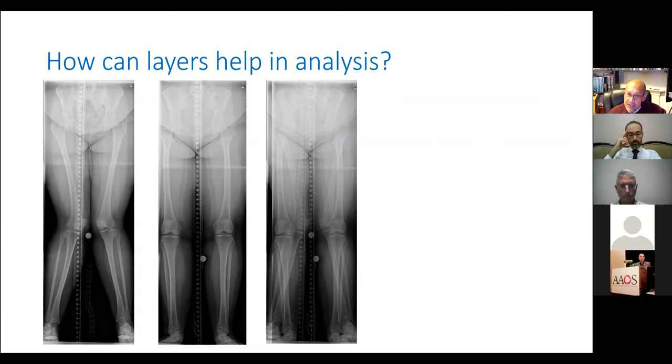If you look at the first X-ray on the left, you can see that the patient has been positioned, as Professor Allam said earlier, with the legs pointing forward. You can see that the patellae have not been centered. But in this standing position, you can see that the tibia is roughly shown in true AP, but the femur at the knee is in an oblique projection.